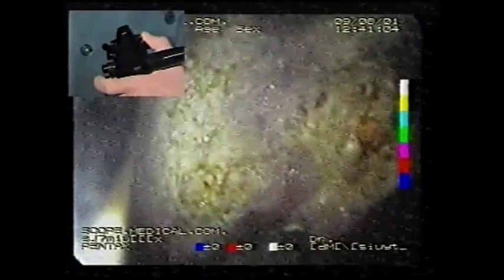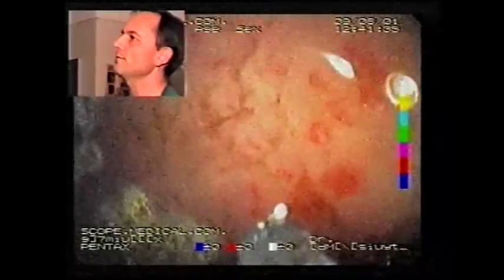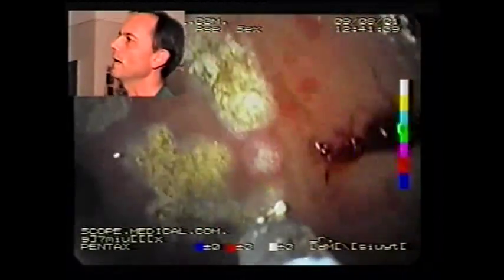Dr. Neuhaus, in other words, what are the limitations for using argon plasma? Is it the time, or is it the surface area you are treating, and what is the interval between two sessions? So we do it, of course, on an outpatient basis. That means after one session, the patient is discharged on the same day, and we recommend proton pump inhibitors to avoid too deep ulceration. Then we repeat the session after 4 weeks. After 4 weeks, the superficial ulceration and erosions have usually disappeared, and then one can repeat the procedure. And you see it's nicely possible. Now it's working much better than in the beginning.